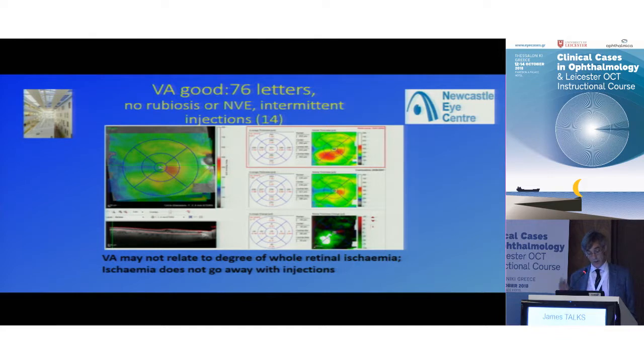So, and I think the ischemia does not go away with these injections. At least this is an example, but we've got other examples. It doesn't seem to go away. It doesn't necessarily get any worse, but it doesn't go away. So I think this patient will definitely need to keep being monitored, and so then that gets to be how reliable are they turning up, etc.